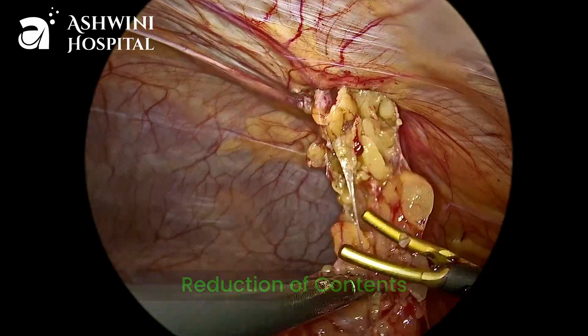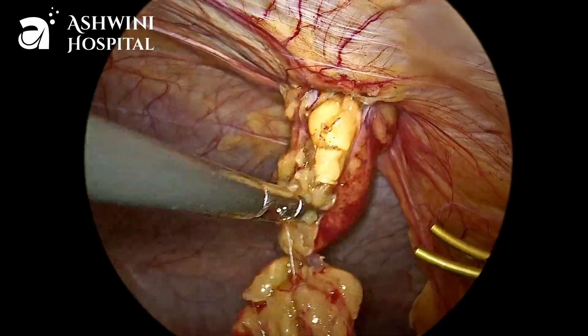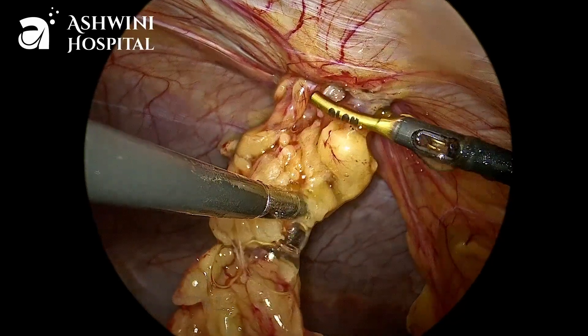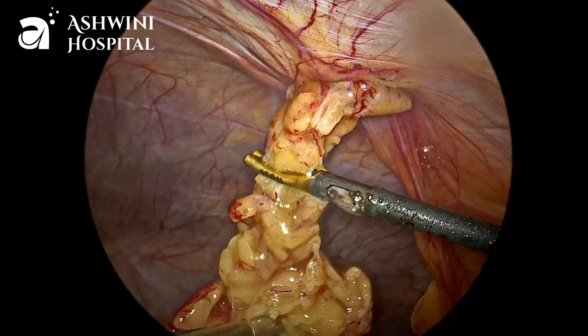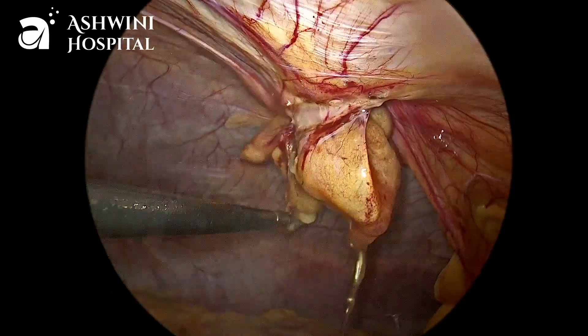Now you can see the contents are slowly getting reduced, and some amount of seroma fluid is also coming out because this is a long-standing hernia. Now the omentum is divided there and the remaining omentum which is in the sac is also slowly pulled out.